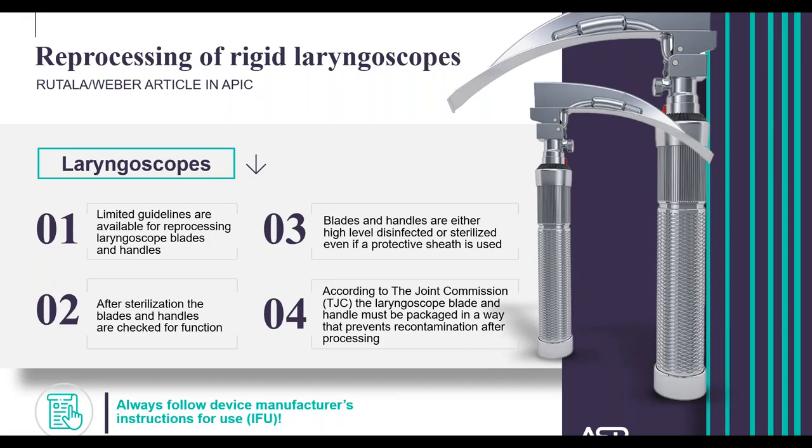Because of some of these recent articles and studies, a question that is now sometimes asked is, is it time to change Spaulding's classification? And while that's not a point of discussion for today, it is something that you may hear about or have already heard about and discussions you yourself may be involved in. So we just wanted to give you a little food for thought.